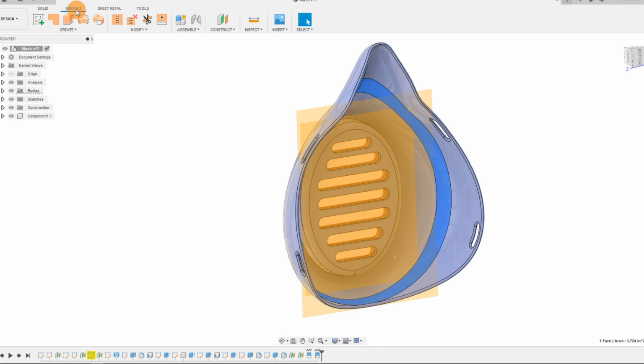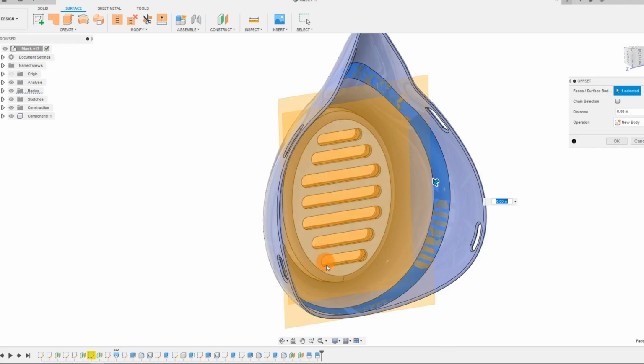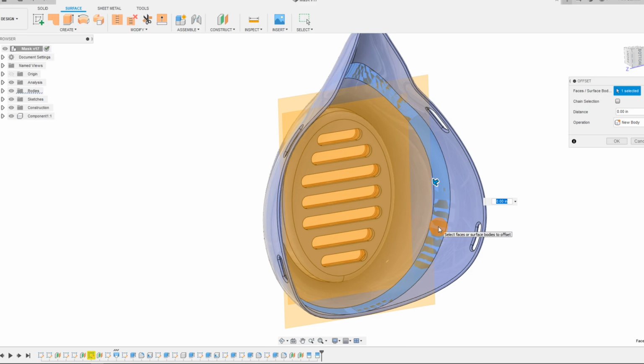So we're going to come to our Surfaces tab here. Now, this is a little bit more advanced, but it's not going to be so difficult that it's impossible to explain. I'm going to come to Create Offset, and I'm going to deselect chain selection because that's messing up my ability to select exactly what I want. I only want to select this ring that we've created, which is created basically from two splits from these two planes that we originally made. So we were able to select it with the surface.